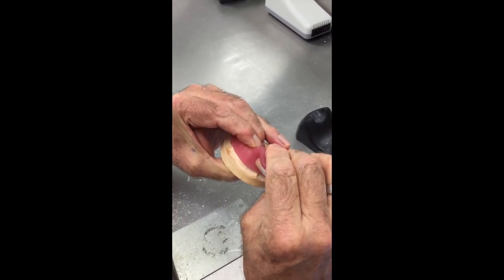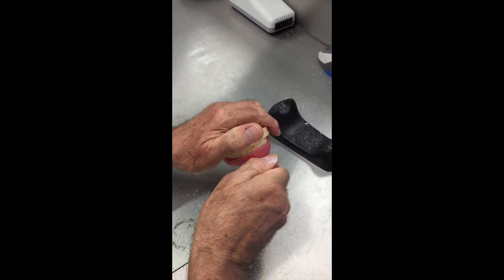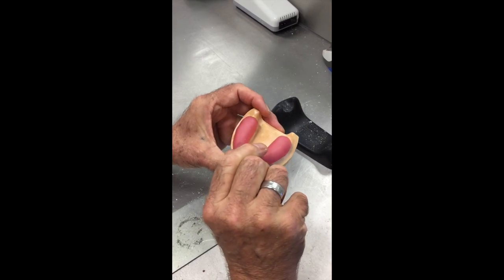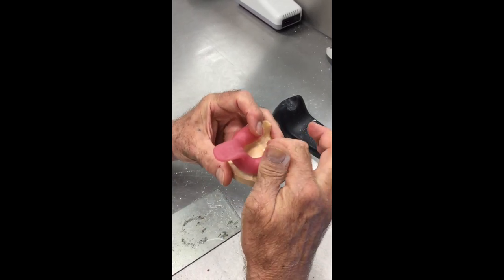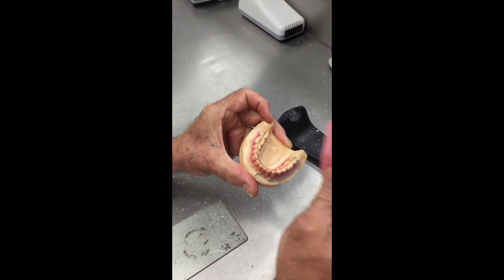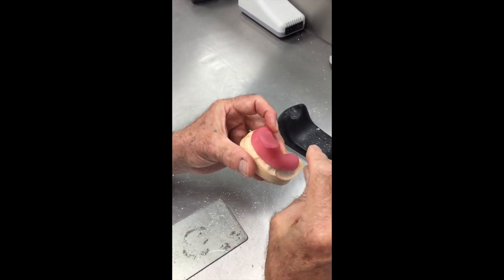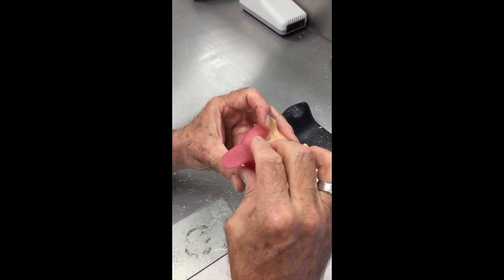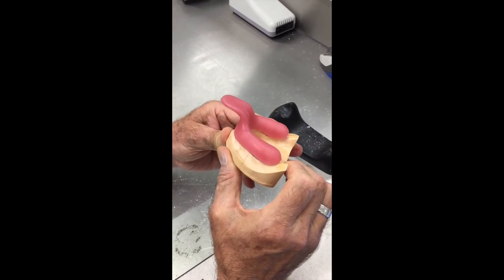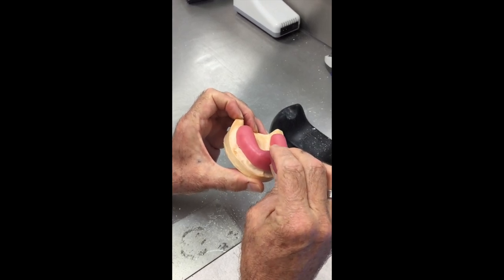Okay, handle is nice and rigid, nice strong bond to here. So if you're placing extra pressure on this to take it out of the mouth, we can do that. We've limited the amount of material that's going to be here by having the tissue stops in there, so it does make this easier to take out than if we had a tray that covered more of the area. Okay, but there's enough there for us to know that we've got a positive seating of the tray. So there is the crown and bridge tray for a single crown on the 3 or the 4-6.